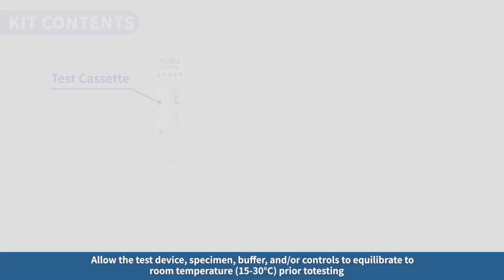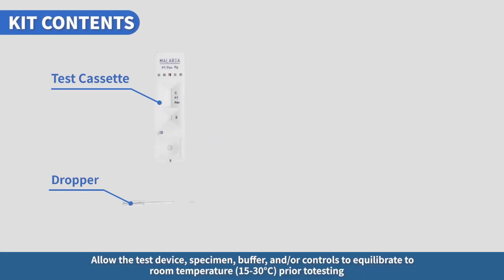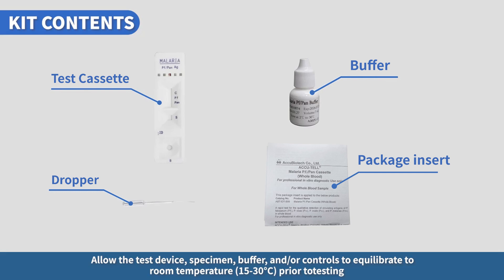Test procedure. Allow the test device, specimen, buffer, and/or controls to equilibrate to room temperature, 15 to 30 degrees Celsius, prior to testing.